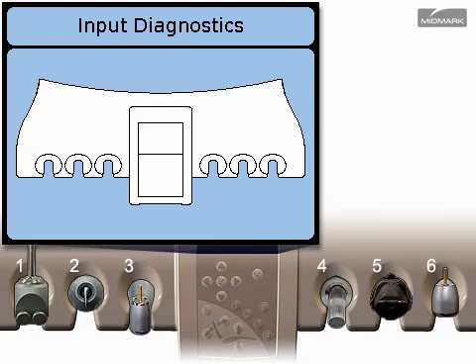A handpiece actuator's optical sensor input can also be tested from this screen. Pull an instrument from the holder and the display highlights its position. If it doesn't, the handpiece actuator's optical sensor is not working properly.